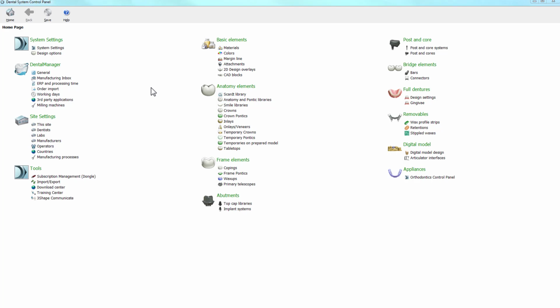Settings and materials created by you can be exported to your customers as a DME file for them to comply with your manufacturing settings. When you intend to set up a manufacturing process in the control panel, the first step is to create a material.